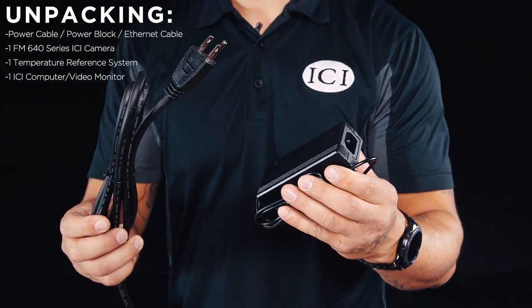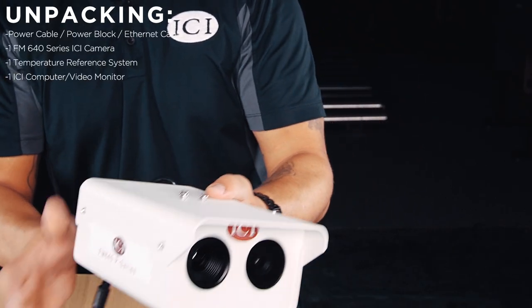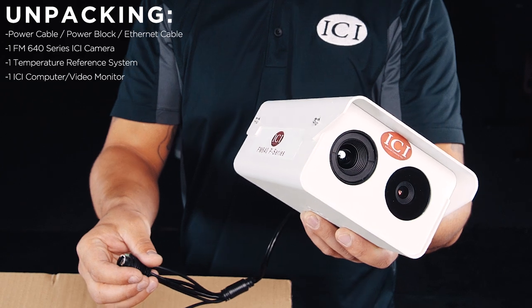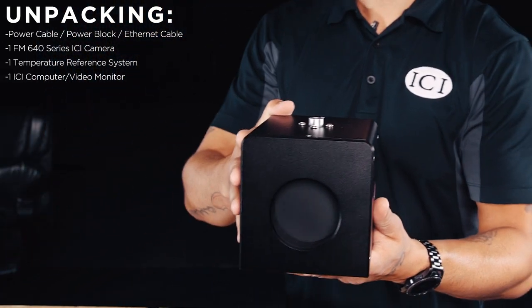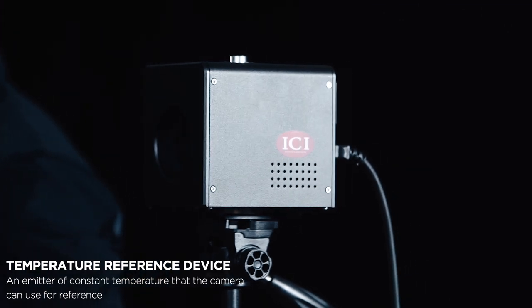You will notice that one end of the power cable has two connections: an ethernet connection and a connection to the power brick. The other end connects to the camera by a pin connector. Here we have the FM 640 infrared temperature screening camera.